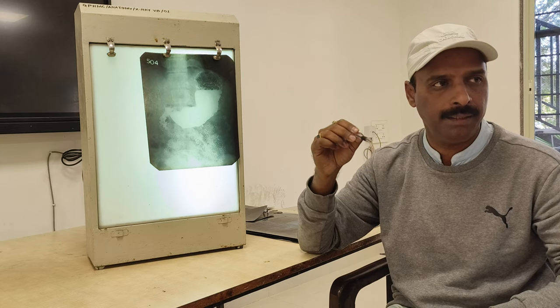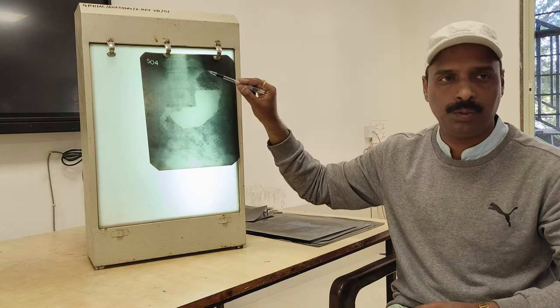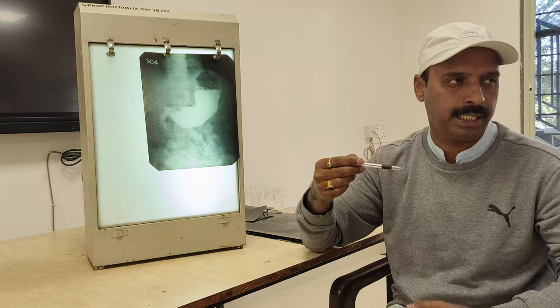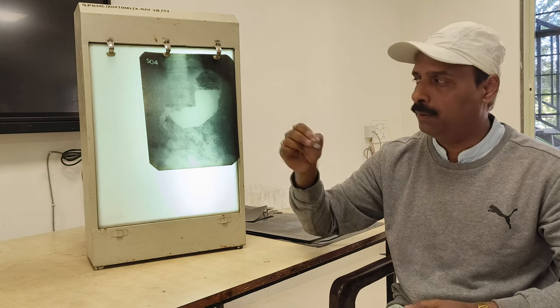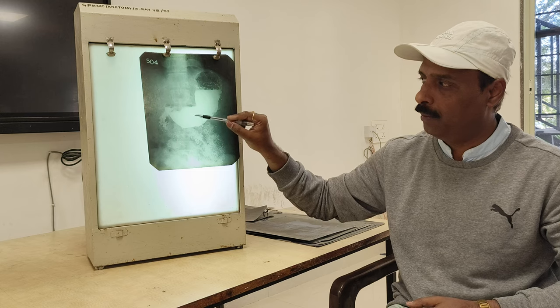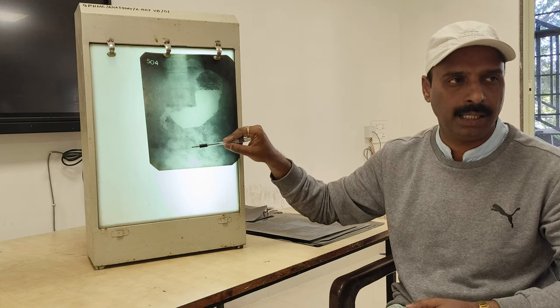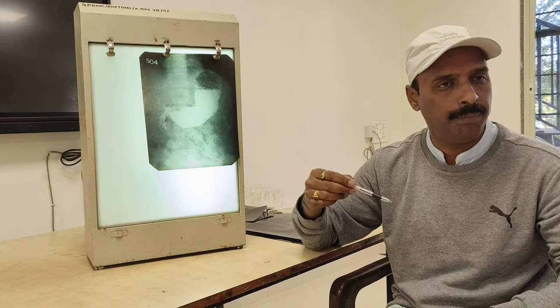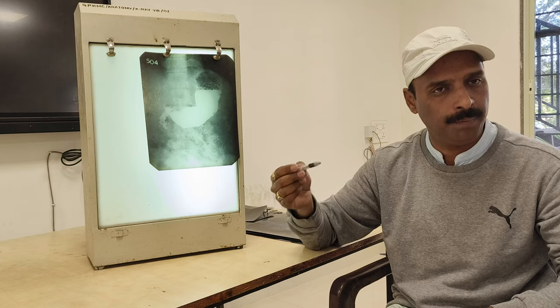BaSO4, barium sulfate, is what the patient is allowed to drink, and afterwards we take a series of x-rays. The next series of x-rays we take is when barium reaches the intestine, and that we call a barium follow through. Barium meal, barium follow through.